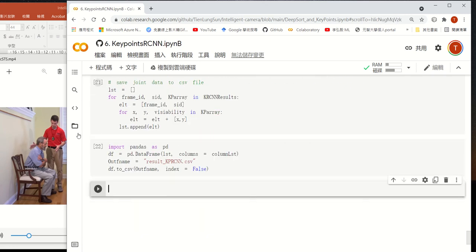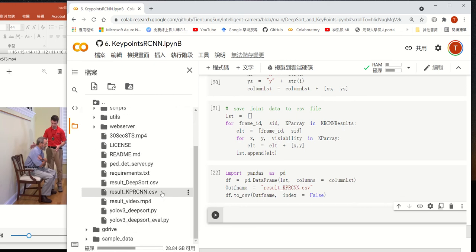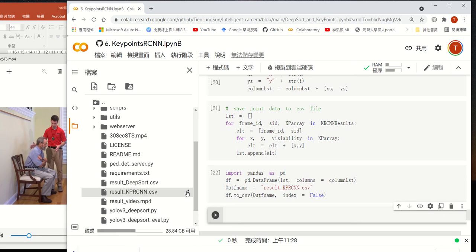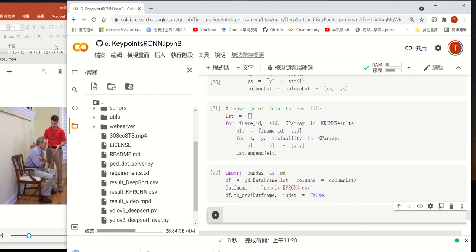Okay, once we finish, go to the DeepSort folder. You can see this result. It's the result video together with 2 CSV files. Let's download them first. We download from Colab to our own computer and start to analyze the data.